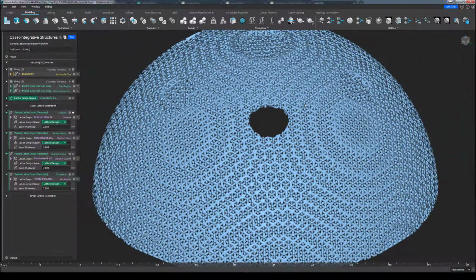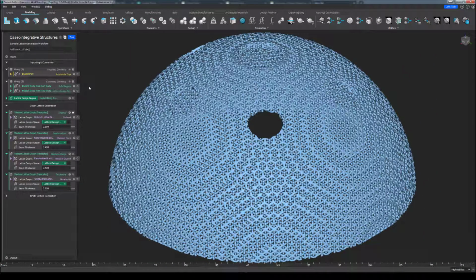The simplicity of these custom blocks is that they wrap up a lot of the math and calculations that are typically recommended when attempting to make effective osseointegrative structures in nTopology. Concealing them inside these blocks ensures that only the inputs that really matter to the user are available and modifiable. Now, of course, you can always look inside of these blocks or read the provided PDF documentation to see exactly what is going on, but the general idea is that the customization of the structure is what is available at this surface level, and the concealment of all the underlying functionality is to avoid any accidental changes and just make things easier to use overall.